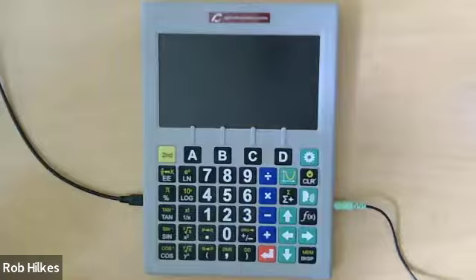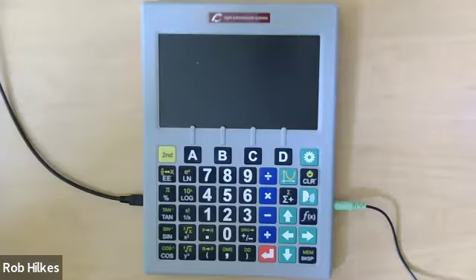Get a look at my face because I'm switching my camera to a down-looking camera that's on my desk so that we can all see what we're talking about. So this is the Psi Plus. This actual model is called the Psi Plus 3500, which is one of the types of talking, graphing, well, scientific calculators for people with vision loss that Sight Enhancement makes. This one, the 35, the all bells and whistles version, outputs in several languages, and it also graphs.